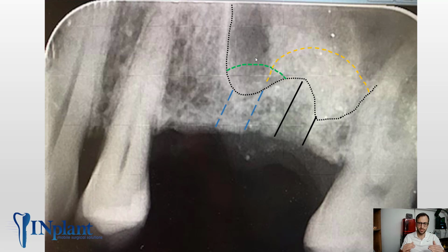They just will continue to lift that tissue off the floor, and we'll end up with a lift that's going to give us a complete lift, completely out of the way. The Schneiderian membrane will lift easily, and we'll have a lot more bone lifted, and I think we would avoid the complication.